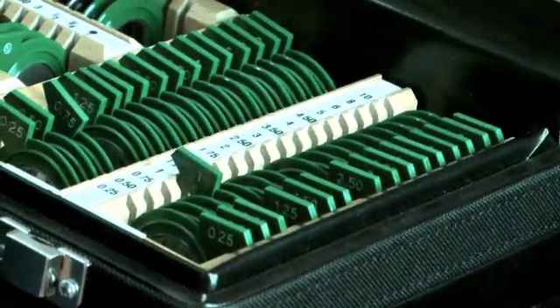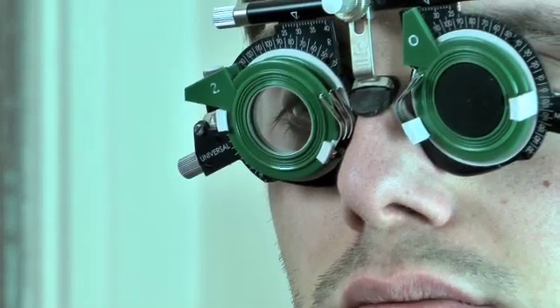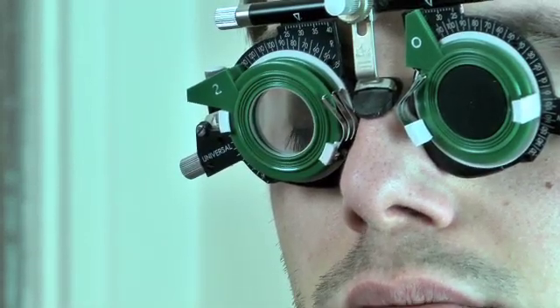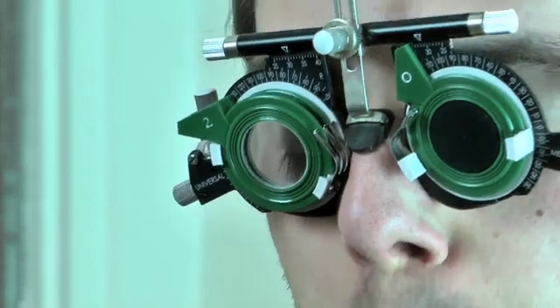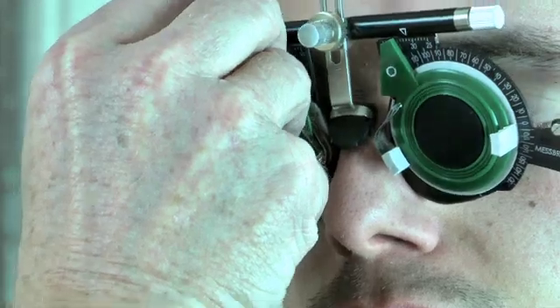That's the plus two, so he's now got plus three in the trial frame. If he says that is worse than it was with the plus one extra added, we can then reduce it. So we take the two out, and we can put a plus 1.50 in.